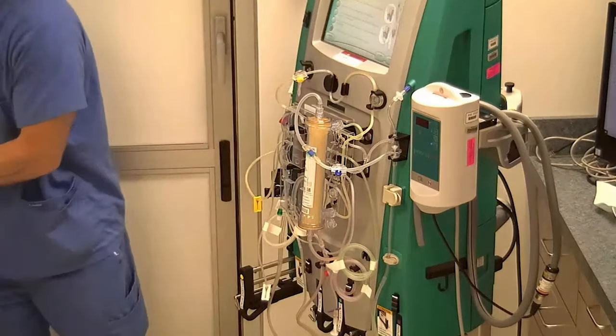And then if you were ordered any patient fluid removal, you will skip over here to patient fluid removal and say they wanted 50 off an hour. We will program that in right there, and we will confirm. And this screen is where we are going to review our prescription, what the doctor has ordered. We want to make sure that is exactly what is ordered in the computer. And then from here, we're going to hit continue.